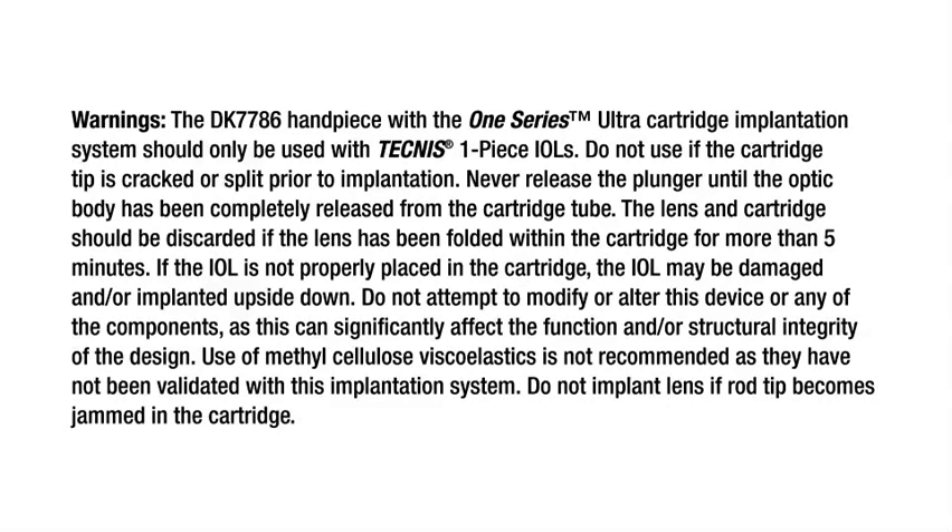Do not use if the cartridge tip is cracked or split prior to implantation. Never release the plunger until the optic body has been completely released from the cartridge tube. The lens and cartridge should be discarded if the lens has been folded within the cartridge for more than five minutes. If the IOL is not properly placed in the cartridge, the IOL may be damaged and/or implanted upside down.